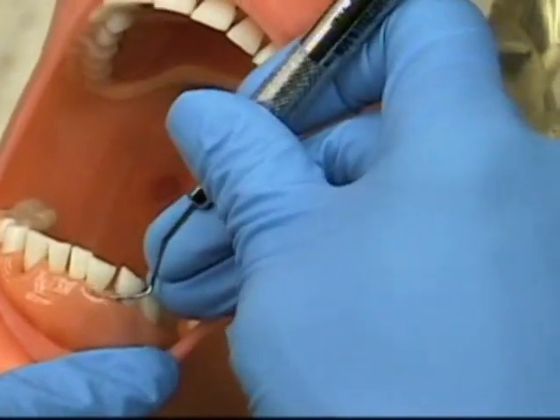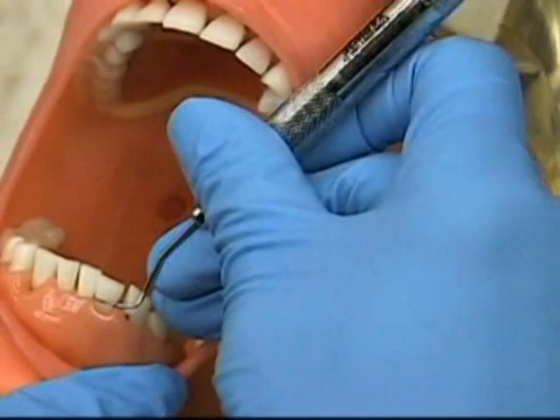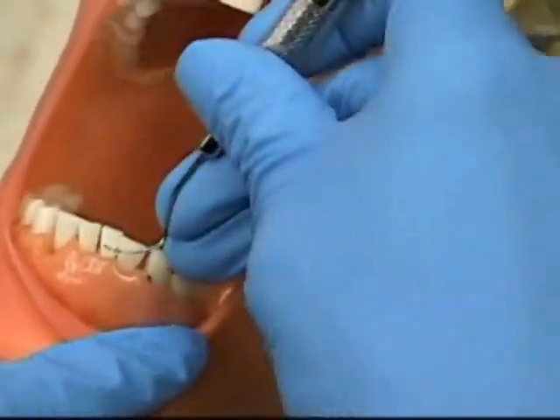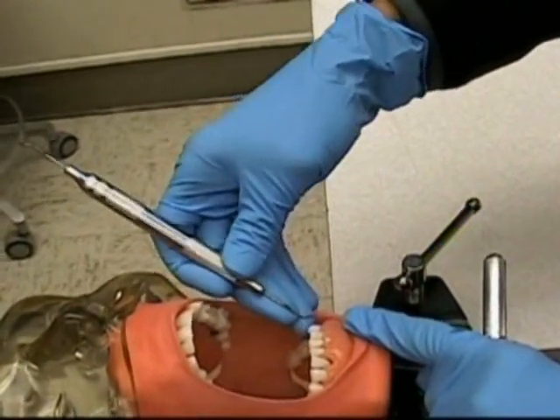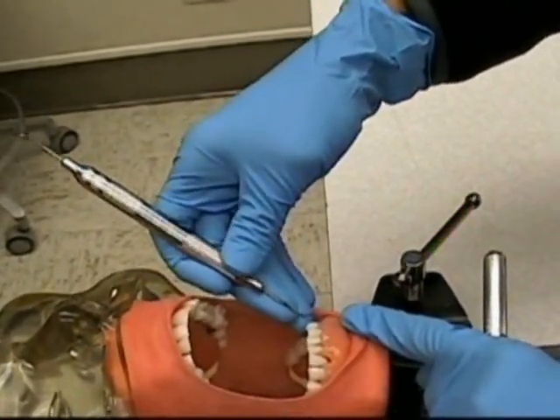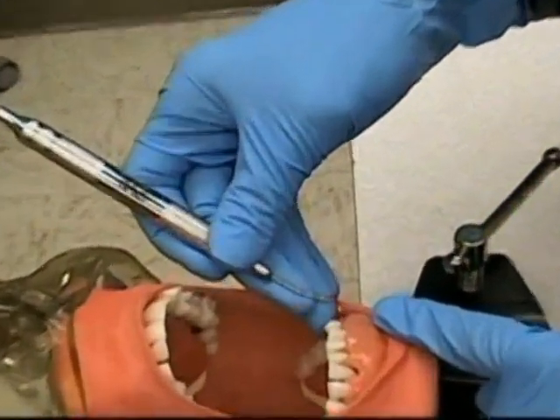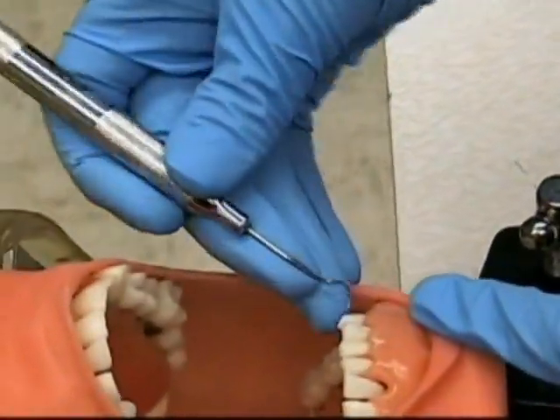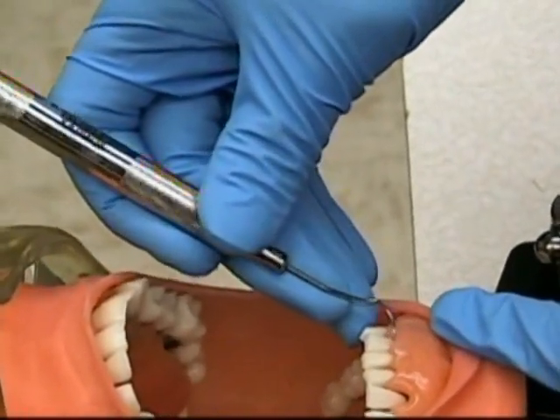Go on to the next tooth. Start at the midline, roll interproximally. We're exploring the lower anteriors, surfaces towards you. Rock the wrist and roll interproximally, beginning at the midline and rocking.